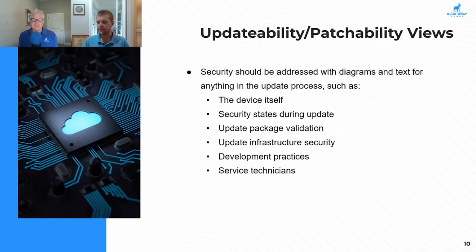Yep. That's, I would say, one of our unfortunately far too common vulnerabilities. One of our most common ones that we see is being able to sideload operating systems. Things in the BIOS aren't protected. The OS update process might not be protected, since that's usually going to break us out of any kiosk mode or sandboxing that we're in. And so security states can get far weaker during update processes if they're not properly addressed.